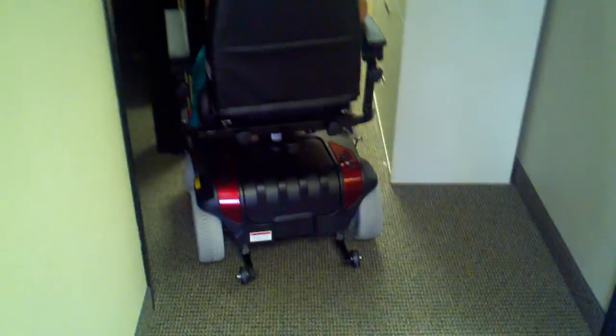So it could go in a complete circle, which is good. Okay, now just kind of drive it around here and see how maneuverable it is. Just kind of take it around. You're doing good. This is the first time you've ever driven one of these, so this is a good test of showing our viewers. It takes a little getting used to, but you're doing great. Okay, now back it up.